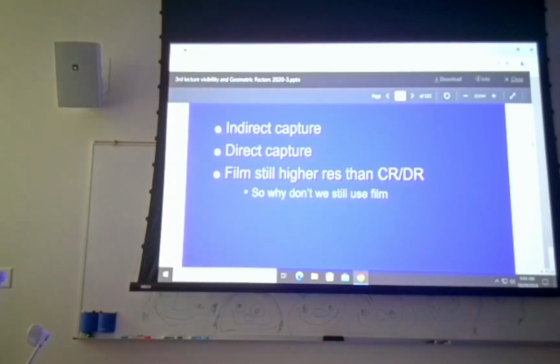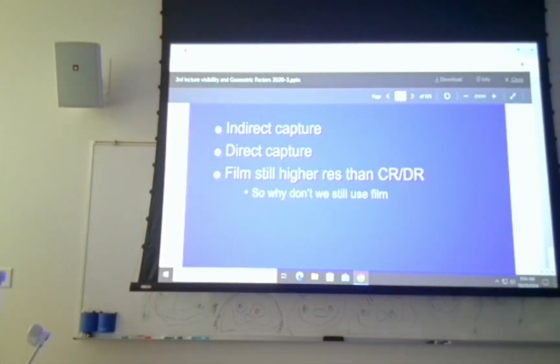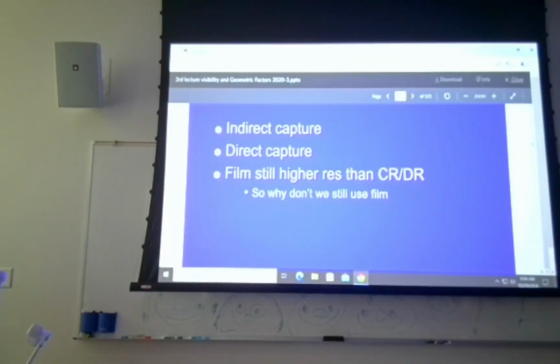What I'm about to say is more obvious when we get into things where screens and films, and fog especially, create such an issue with the image that the benefit of CR and DR and that computer algorithm bringing out that contrast really shines. So in things like feet, where we used to have to shoot 2 images for each foot, or maybe set a technique for what portion of the foot actually hurts, you can now get from toes to the proximal portion of the foot and visualize all the way across, from distal foot to proximal foot.